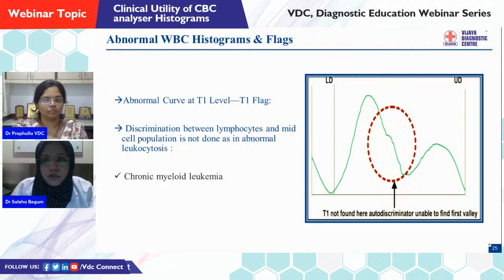Coming to this variation here, there is an abnormal curve at the T1 level. The T1 flag is there. The T1 discriminator is not found here. It is unable to differentiate the first valley from the small lymphocyte population.